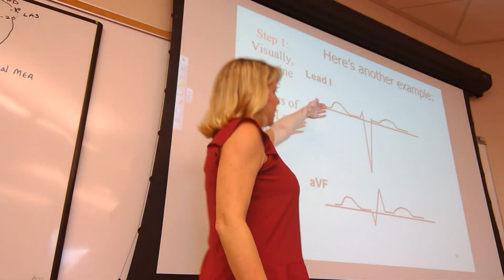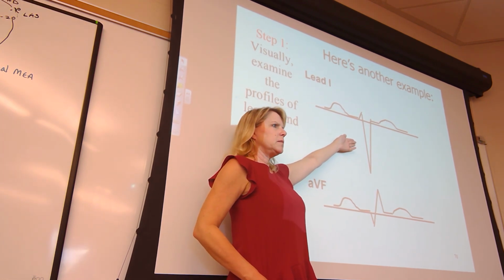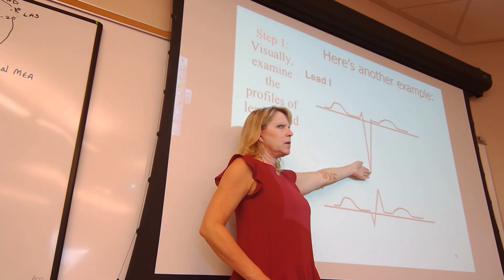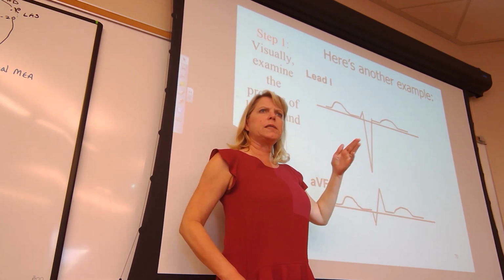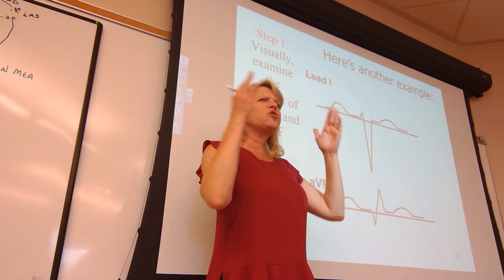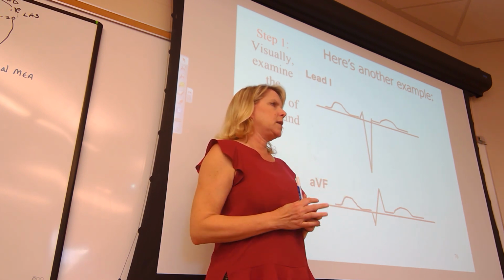for lead 1, what is the algebraic sum? Negative, overall negative. Very negative, I would say. Clear as day, negative. How would you shade that in a circle if lead 1 was drawn in that circle?